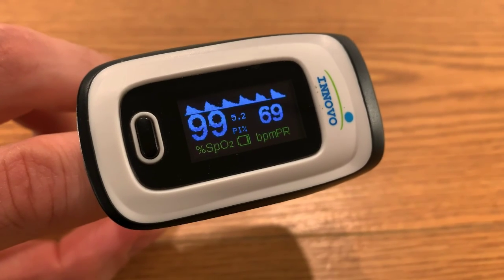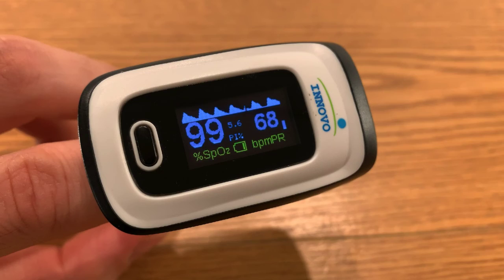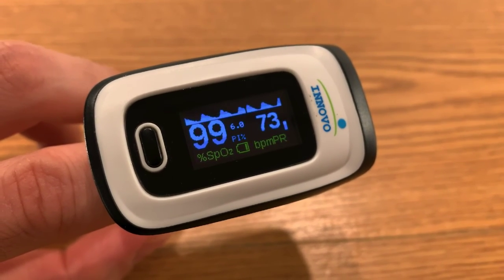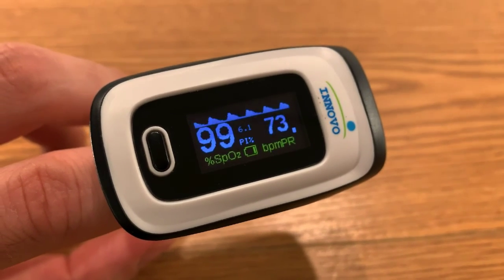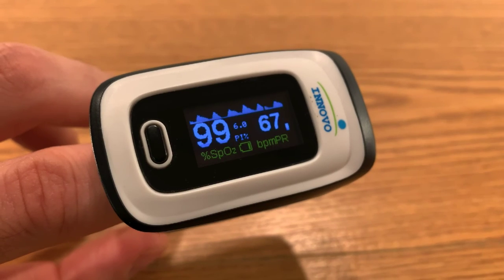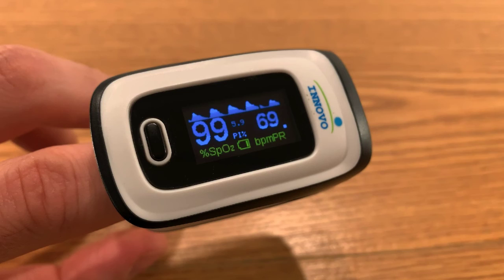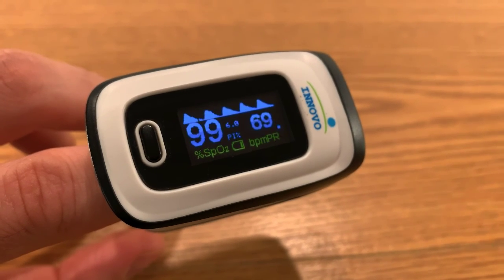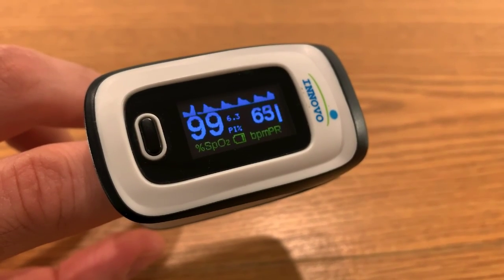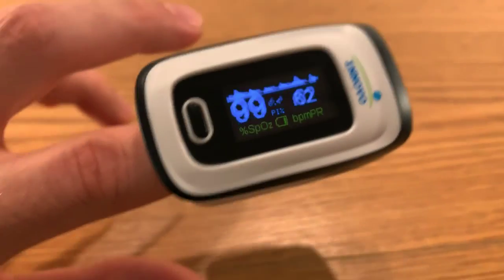At night before bed I would just practice and pay attention. During the daytime when you're active it's going to be a little bit higher. The lowest I've gotten it to go so far was 49 beats per minute, and that was in bed.